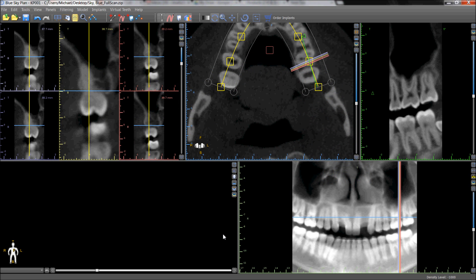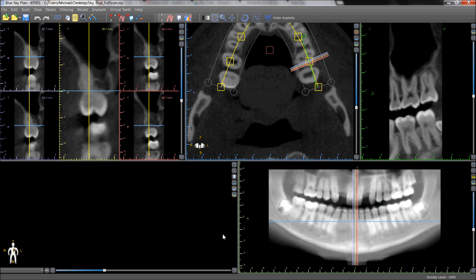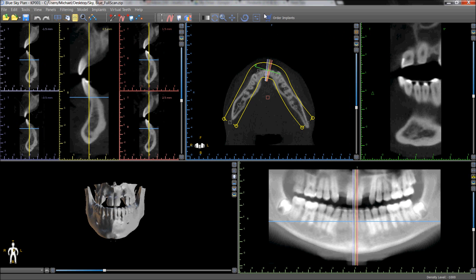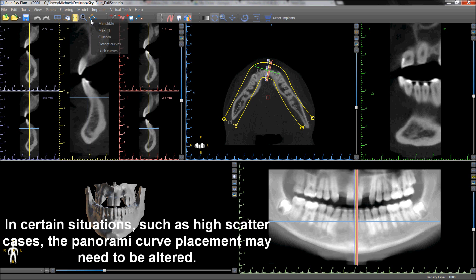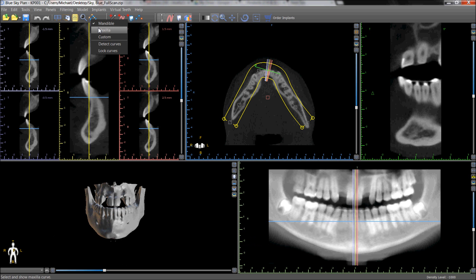When a new case is loaded into the BlueSkyPlan software, BlueSkyPlan automatically correctly places the panoramic curve in the proper location. Pressing the new panoramic curve button in the horizontal toolbar allows the user to toggle to the second jaw and see the new panoramic curve properly placed in the opposing jaw.